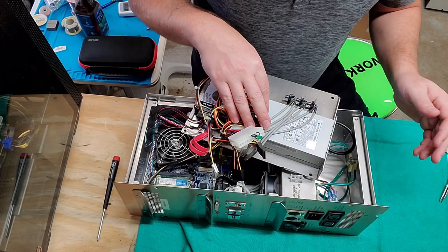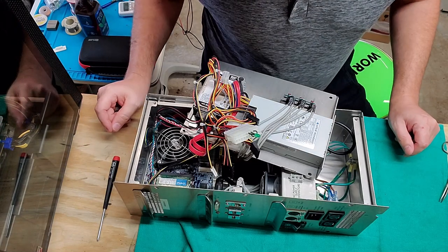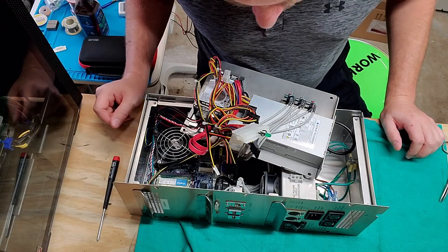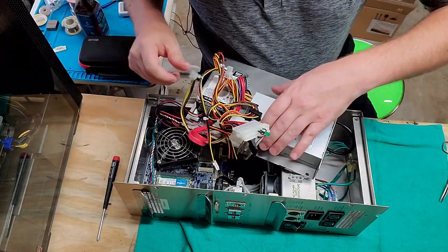So as soon as mains is connected, this guy is on 24/7. It doesn't shut down like a normal power supply. So that's good to know. This guy is on all the time. I wonder how dirty it is. All right, let's go ahead and disconnect the power.